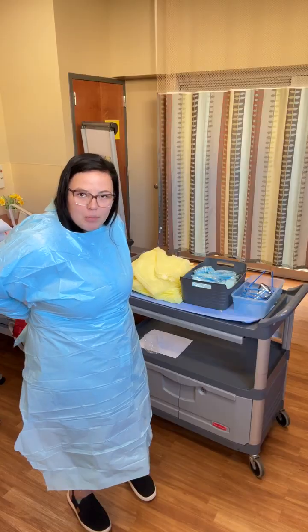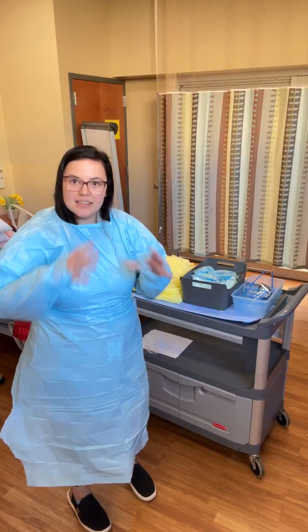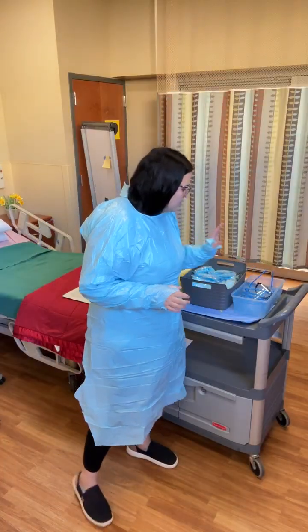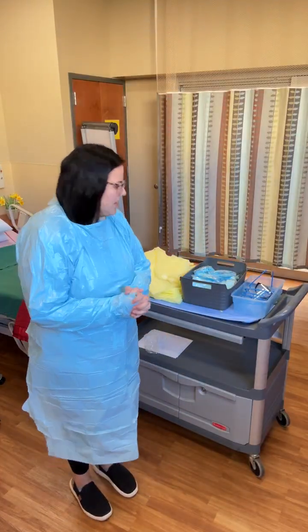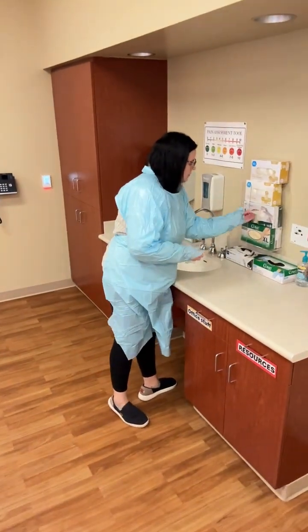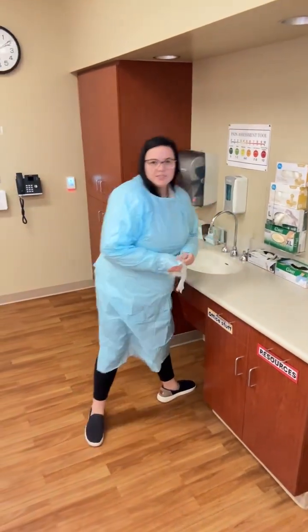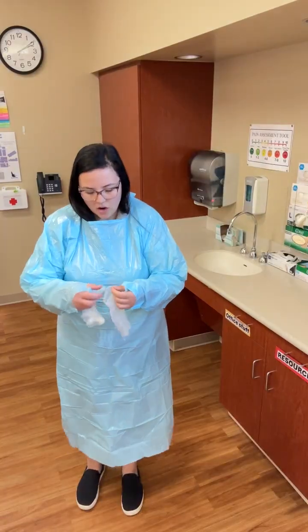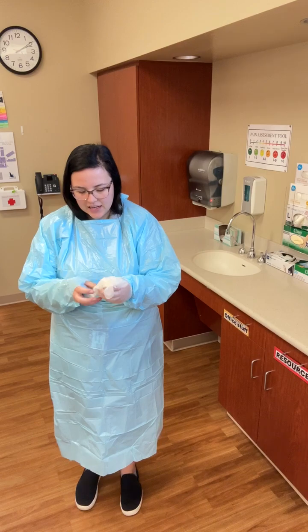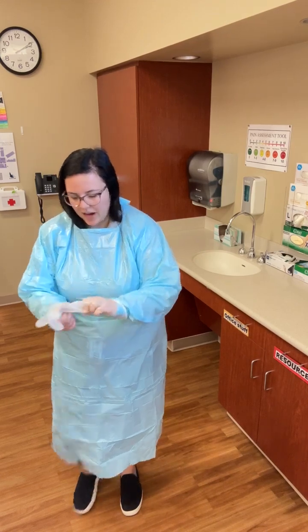We will just have you verbalize the fact that you are going to put a mask on, and you will verbalize that you're going to put on the goggles, but as long as you verbalize it, you'll be good. Then you'll grab gloves, which are over here. There are different stages with Stan, so once you come in and you have your gown on, you're just going to keep that gown with you. You're not going to throw it away, so that you can use it again when you come back into the scenario. So then you get your gloves on, and you are ready to go.